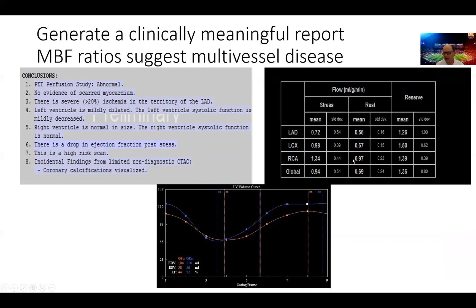Again, we report the myocardial blood flow on this patient showing the involvement of other territories besides the LAD in the ischemia at least by myocardial blood flow and blood flow reserve here.